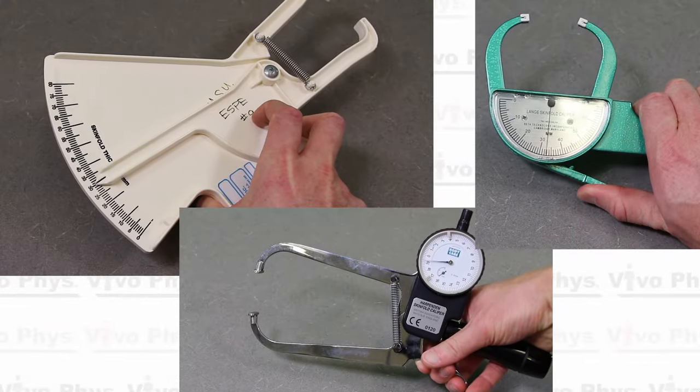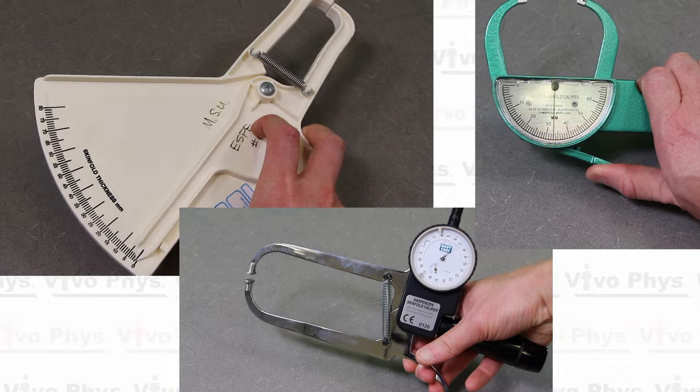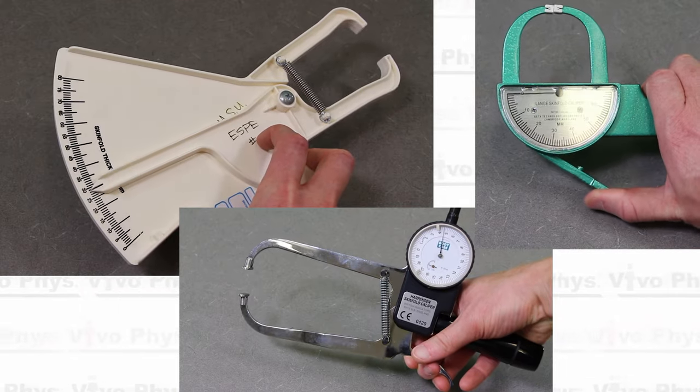Regardless of what kind of skinfold caliper you're going to be using, you're going to have some sort of a lever arm that's going to allow you to open up the caliper. When you do that, you're going to see that the dial that's reading off millimeters is going to change. That's essentially how this technology works.